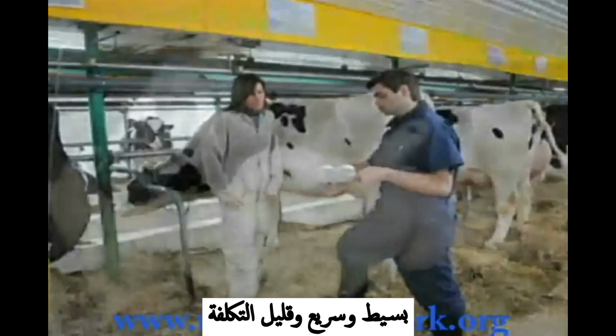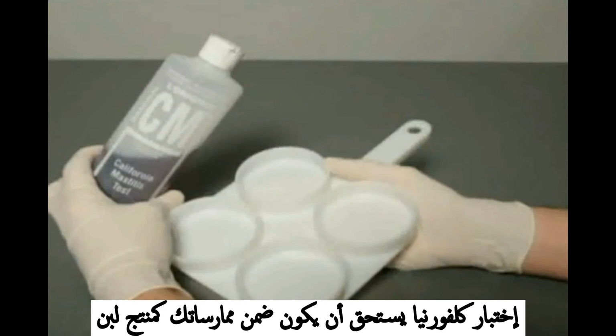Simple, quick, and low cost, the CMT is worth including in your dairying routine.